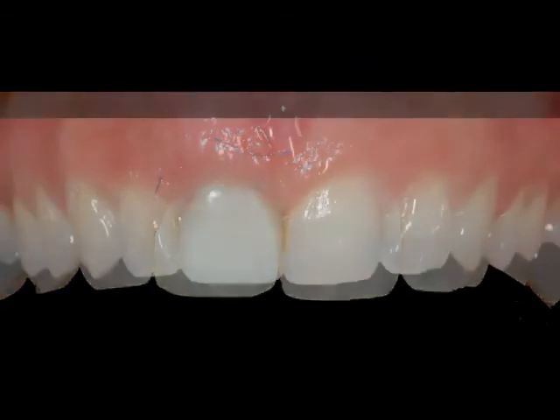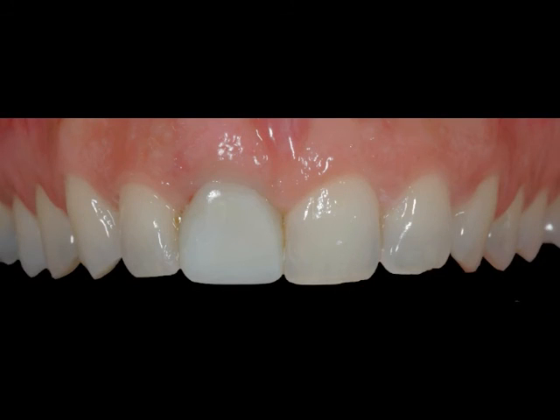On the second part of this presentation, we will show step by step how we create our second provisional restoration, you see here, and finish with a definitive restoration and the final outcome.